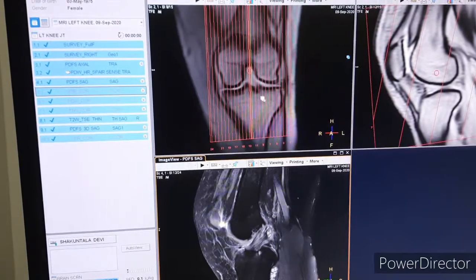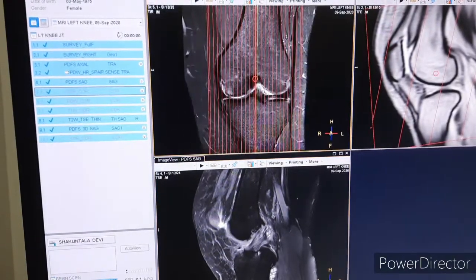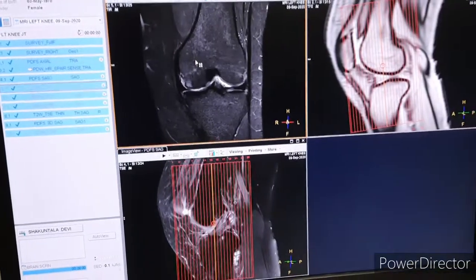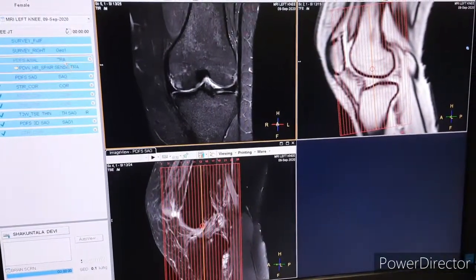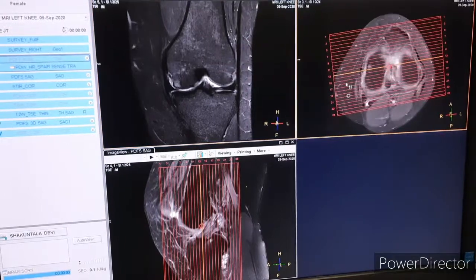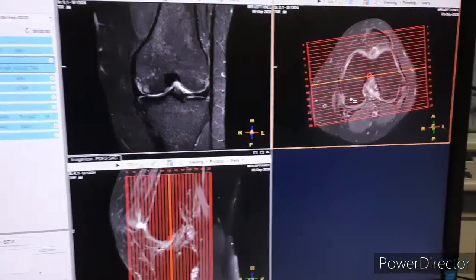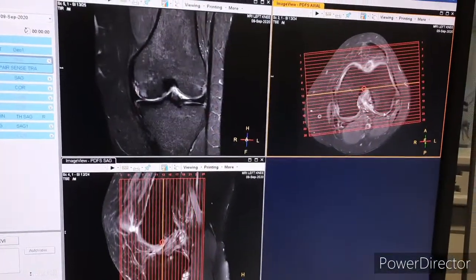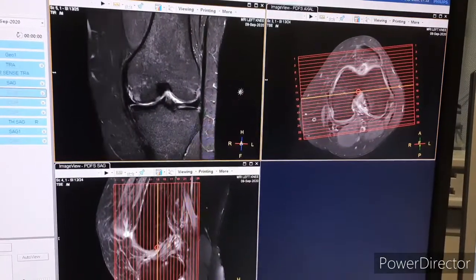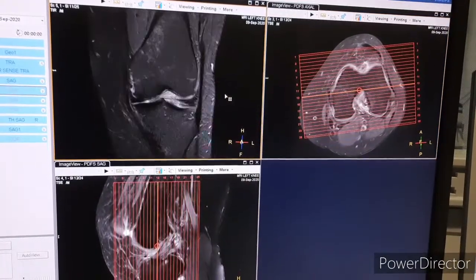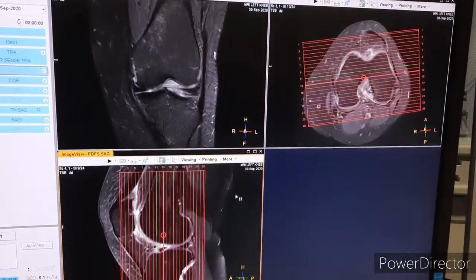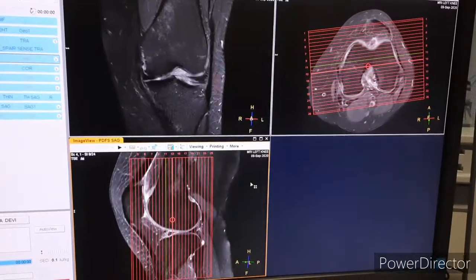Next is coronal — STIR coronal. You can see the planning. Again, we have set the planning according to the condyles. Make sure your area of interest — region of interest — is covered.